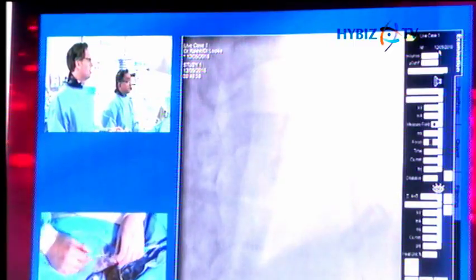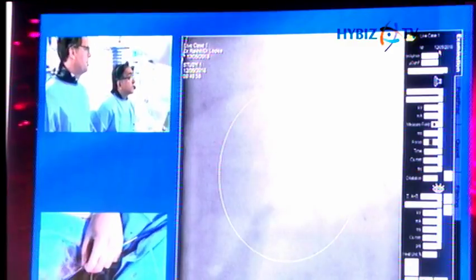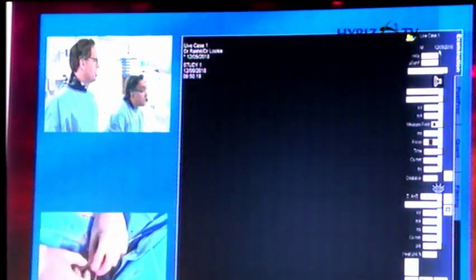So I'm just post-dilating the distal portion of the stent with a 3.5 NC. And then we're going to take a larger balloon for the proximal segment. We can take a 5. Now, please. So you can see the markers on the stent, which actually make it very easy to post-dilate. Just come back a little bit, I think.